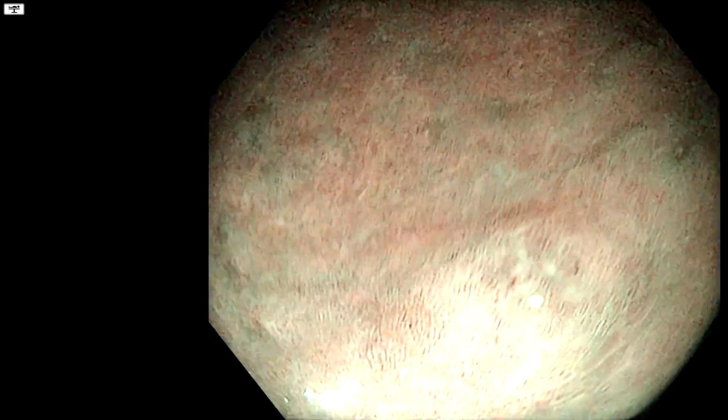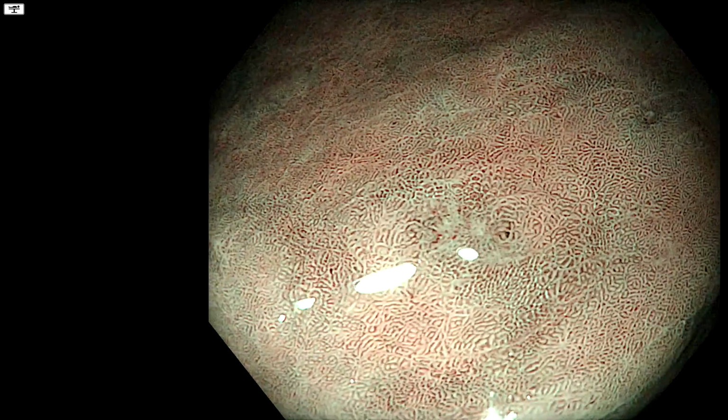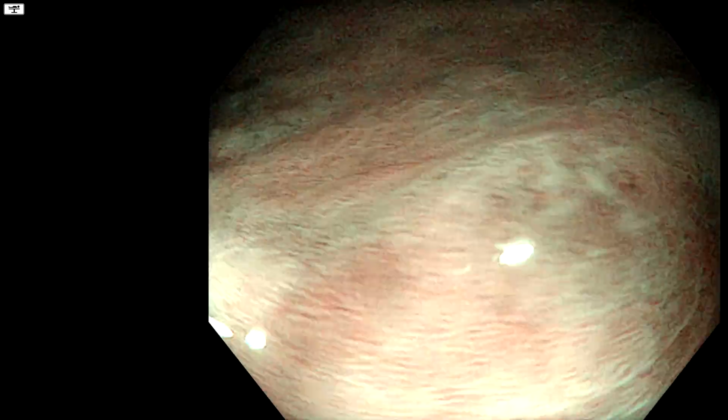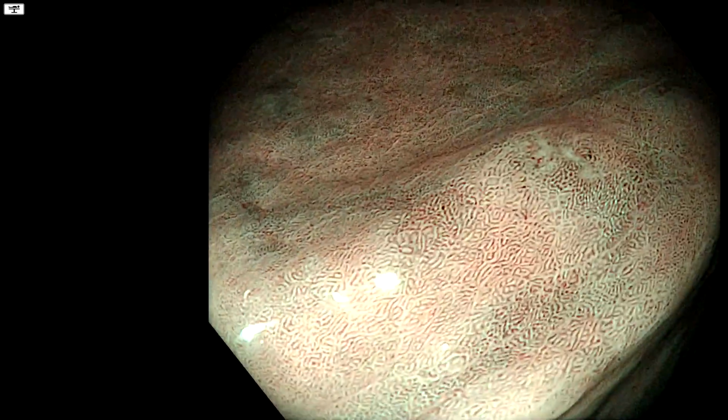Let's scan around until we find one. This is maybe another zone where you could say, okay, this maybe looks like something. But again, the pattern is pretty regular and it's certainly not totally disordered. It doesn't really form anything. There's a bit of fibrin on the surface, and again you have that darker-than-background appearance, suggesting there might be inflammation present.